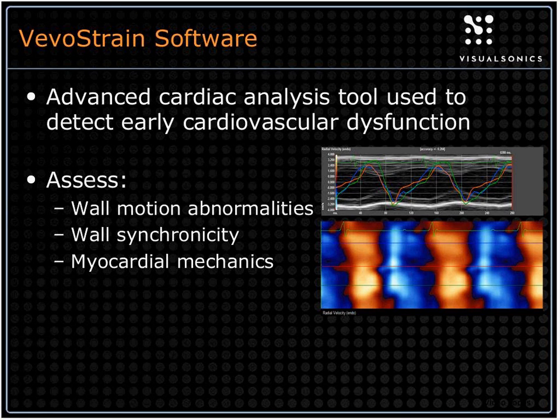So what is VevoStrain software? Our VevoStrain software is an advanced cardiac analysis tool that is used, again, to detect early cardiovascular dysfunction. What it's focused on is assessing wall motion abnormalities, wall synchronicity, and cardiac mechanics.